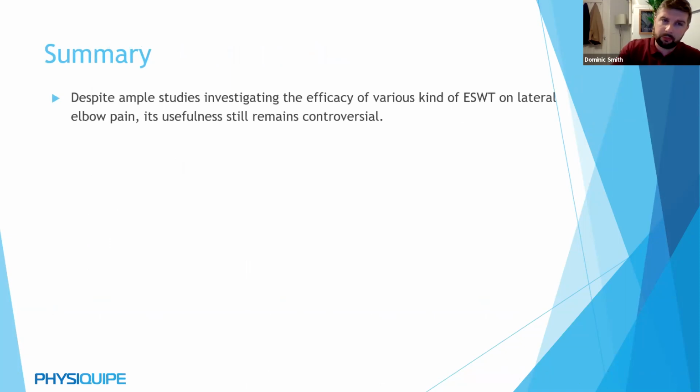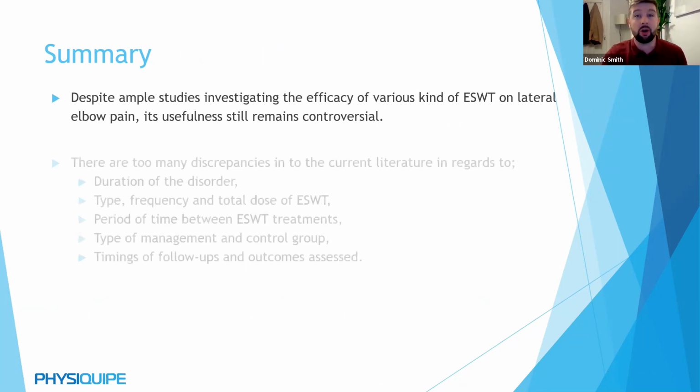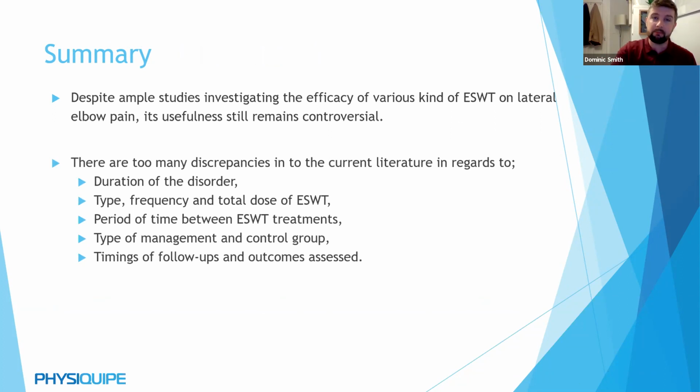So in summary, there have been ample studies in this area, yet depending on who you speak to, it's still a little bit of a controversial area on its effectiveness. I clinically have had some very good results. On the flip side, I've also had some patients that haven't responded whatsoever. There are other variables, like they might not do their exercise rehab, they might not be resting as they should be, and anything else. So if it doesn't necessarily work with Shockwave, that's where we might look at different alternatives.